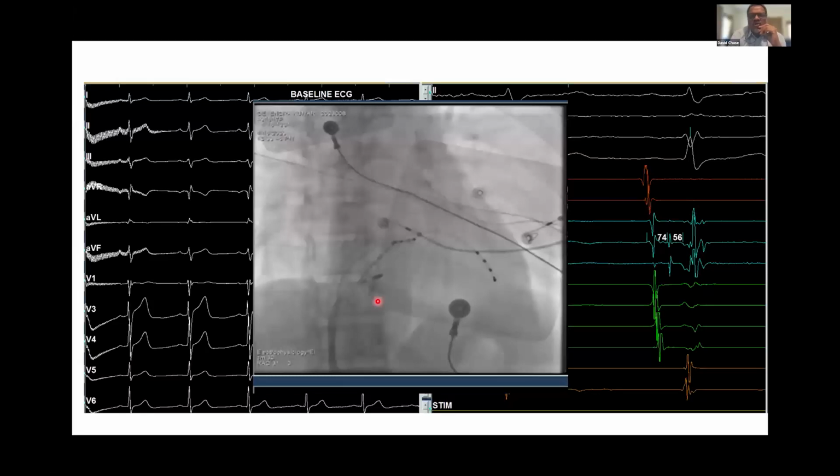So in one view, you may not be able to tell everything, but it's important to know that if we have catheters at a particular position and we see local ventricular EGMs such as what we are seeing here on the His channel or in the atrial channel, and we find evidence of pre-excitation, either during atrial premature beats, whether they occur spontaneously or because of pacing, followed by ventricular pre-excitation, and we find it happening earlier in the V, and it's happening earlier in the left ventricle, we know it's a left-sided pathway.